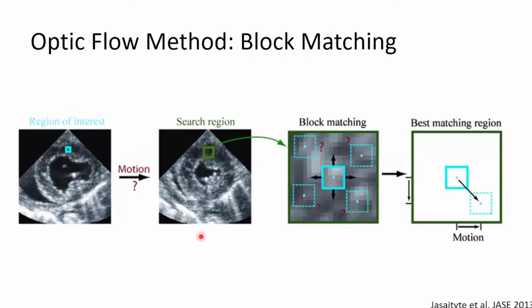But having done some reading on it, it uses basically techniques that are popular for tracking objects within a video sequence. So if you were tracking a person in a video, you may use what are called optical flow methods to track motion and understand how fast that person is moving, or over what time, how much distance was moved, for example.